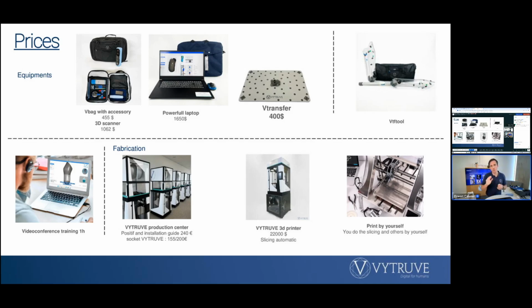After, it's necessary to have a good computer. And you can have the V-transfer plate. It's necessary to have the V-transfer plate, and the V-transfer plate is around $400. So it's for a definitive kit.